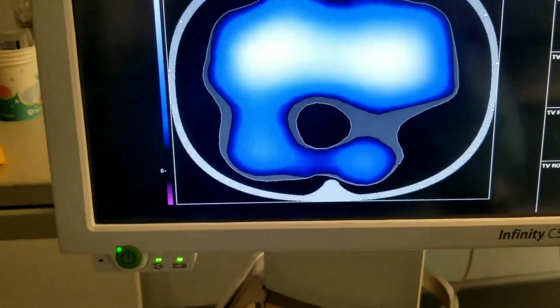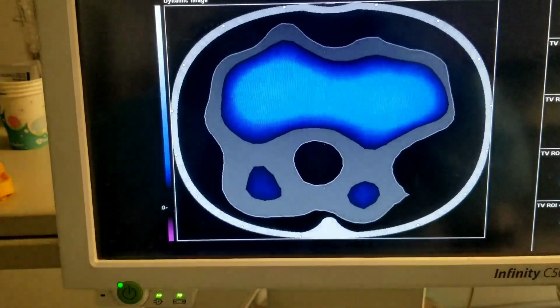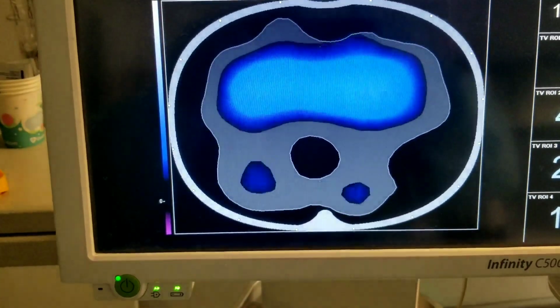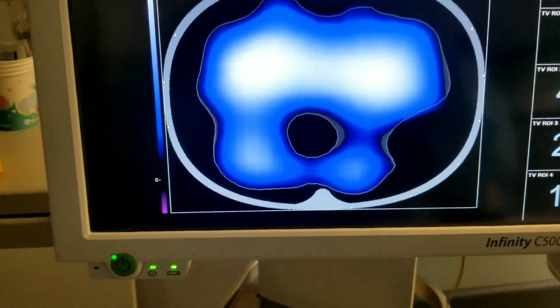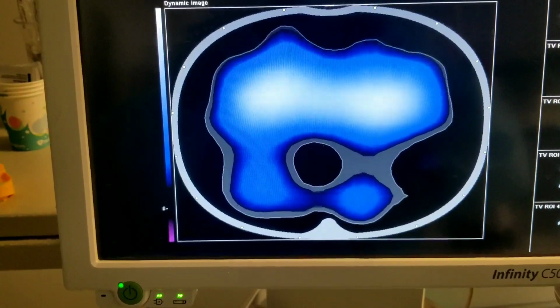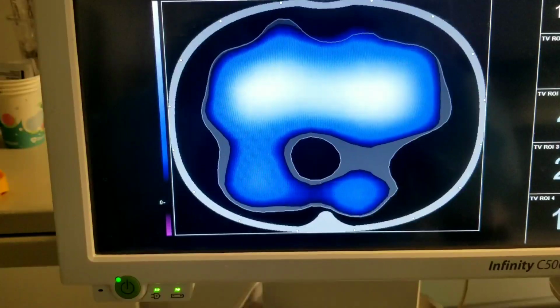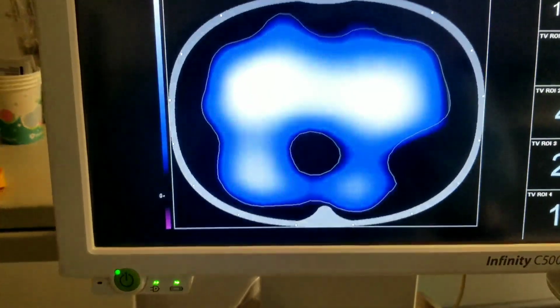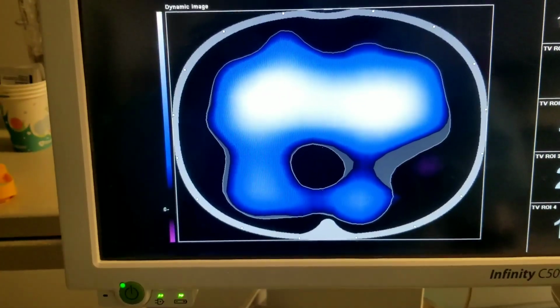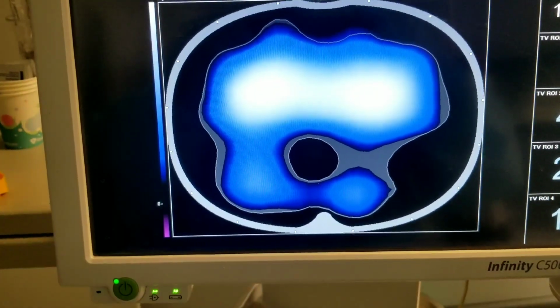So what I suggested was that once the patient was in the ICU, we put the patient in a prone position. So this image, while I've been talking here, is actually about an hour post-op on APRV. So, we're talking about poor distribution to the dorsal region, but actually it's pretty good compared to what it was before. I just don't have that image. The FiO2 requirement was no longer 100% after an hour. We were able to get it down to 85%.